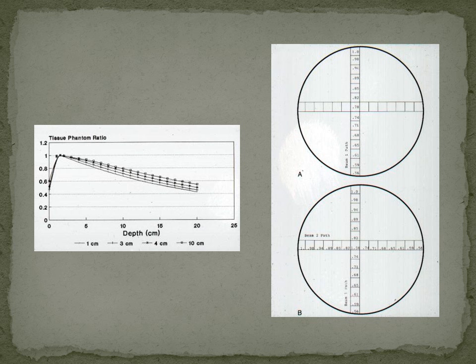All right, so how do we create spheres of dose, and how do we actually do sphere packing? Well, what I have here is just a circle. So this is physics, right? You need a patient, we make a circle. You need a cow, we make a circle. So here's a circle, and what I have is a radiation beam coming in from the top.